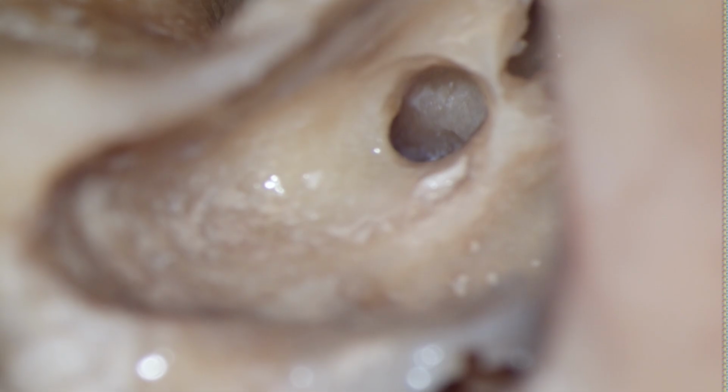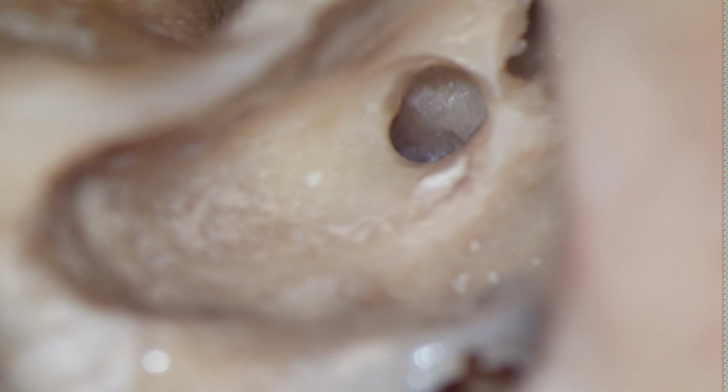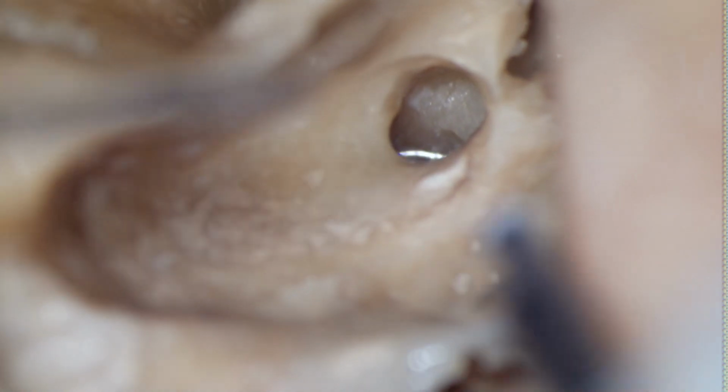This stapes and all the ossicles are absent actually. So first thing which we visualize after posterior tympanotomy is the suprastructure and the tendon basically. Yeah, and then you go inferiorly and you'll find the round window niche, right? So that is the area.